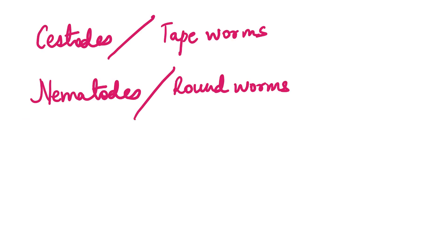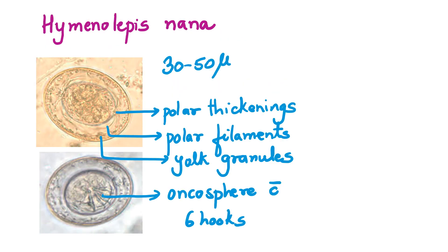Amongst the cestodes, that is the tapeworms, we are going to see the eggs of Hymenolepis nana, Hymenolepis diminuta, Taenia solium, Taenia saginata, and Diphyllobothrium latum. Of course, you're not going to see the eggs of Echinococcus because the eggs are not present in human stool specimens — the eggs of Echinococcus are present in dog feces because the dog is the definitive host. Moving on, we are going to see the eggs of the intestinal nematodes, that is the intestinal roundworms, those found in the large and small intestines. Let's start with the cestode eggs seen in stool specimens, the first of which is the dwarf tapeworm, Hymenolepis nana, the most common cestode infection in humans.